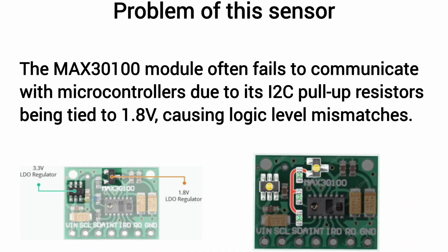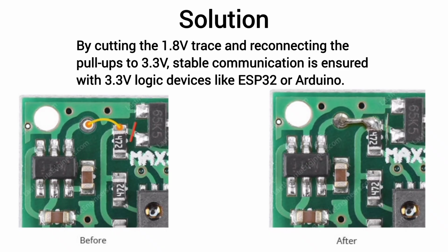However, a common issue with this module is that its I2C pull-up resistors are tied to 1.8 volts, which causes communication problems with 3.3-volt devices like the ESP32. To fix it, simply cut the 1.8-volt trace and reconnect the pull-ups to 3.3 volts for stable operation.